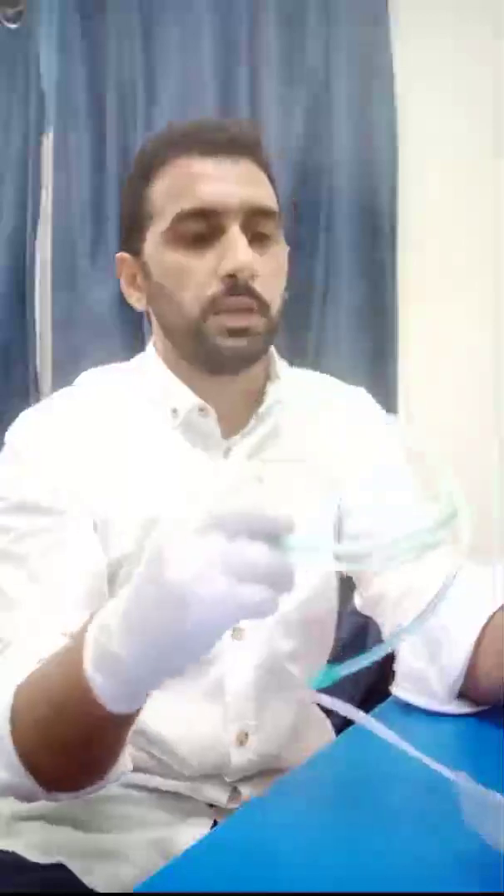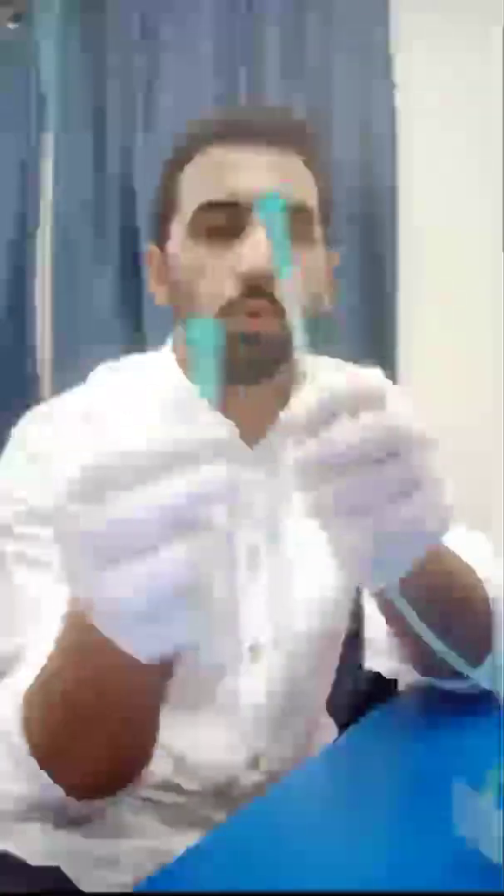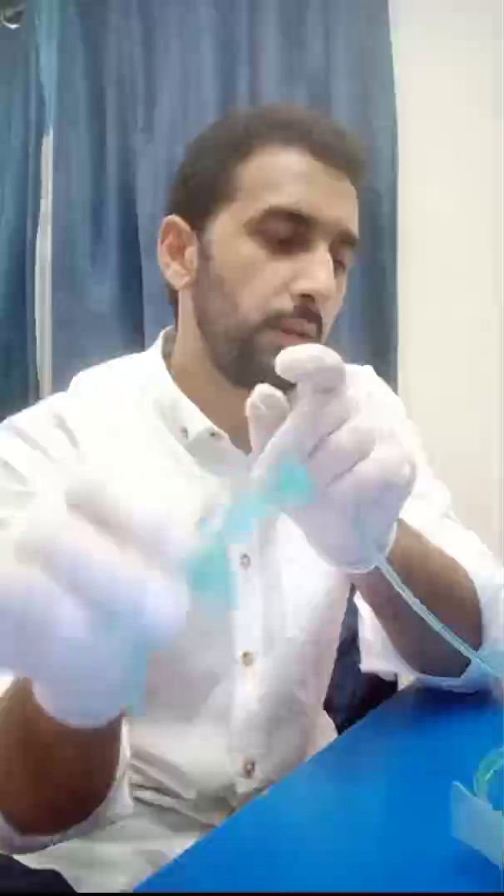Step one: take both ends of the nasal prongs and remove them. To clarify: this is the nasal part and this is the end part. I have already removed them to save time. So take both ends from the nasal prongs and remove them — those are the two ends of the nasal prongs.